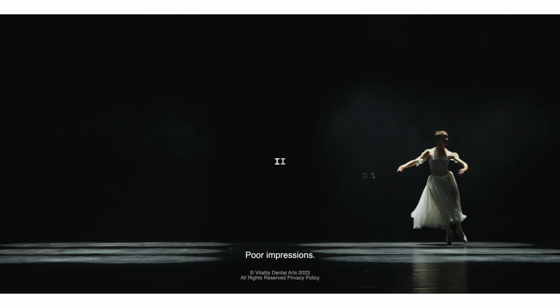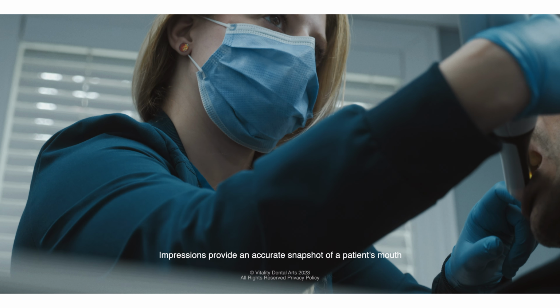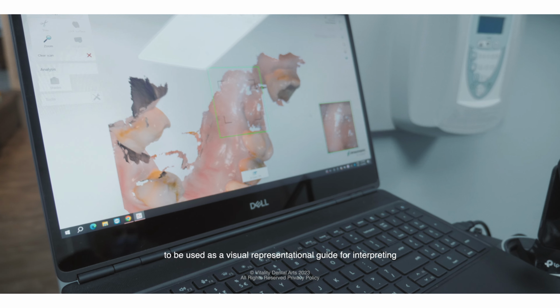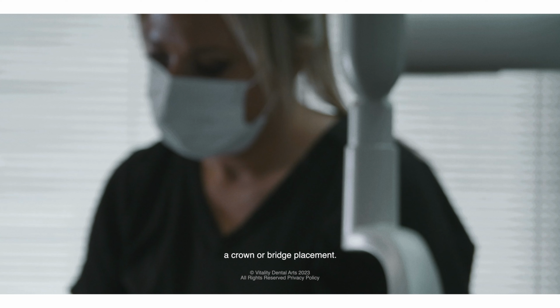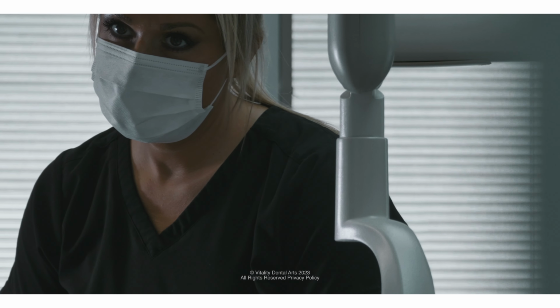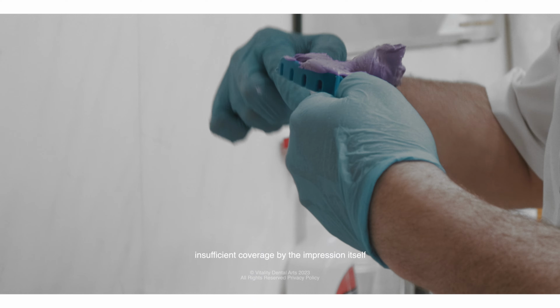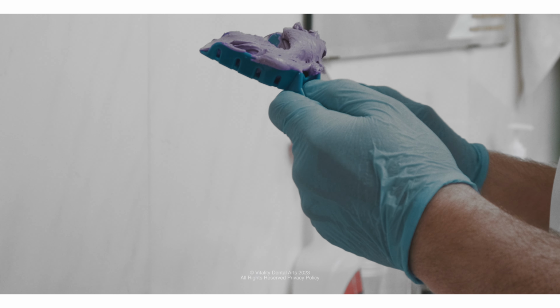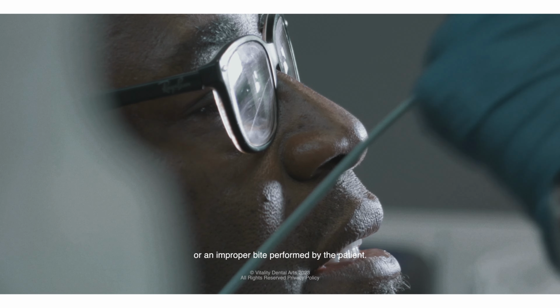2. Poor impressions. Impressions provide an accurate snapshot of a patient's mouth to be used as a visual representational guide for interpreting a crown or bridge placement. Indicative factors of a poor impression include insufficient coverage by the impression itself, prematurely removing the impression material before it is fully set, or an improper bite performed by the patient.